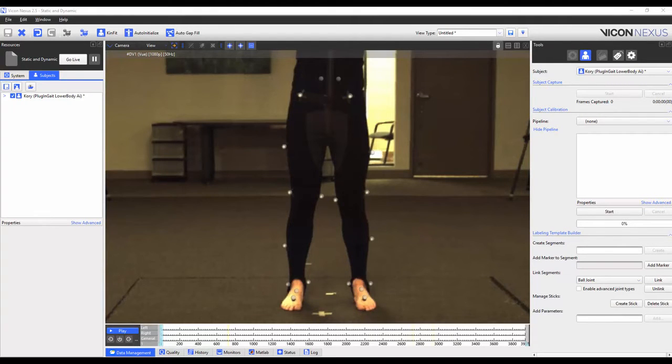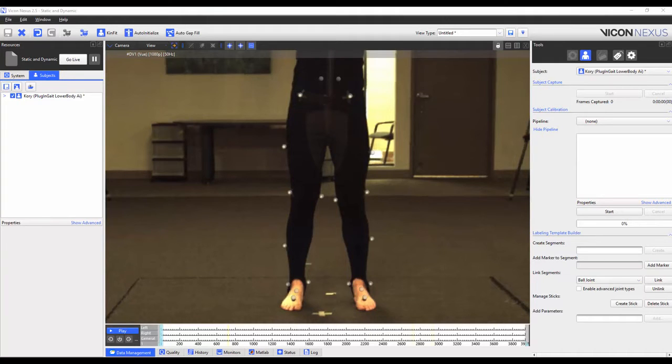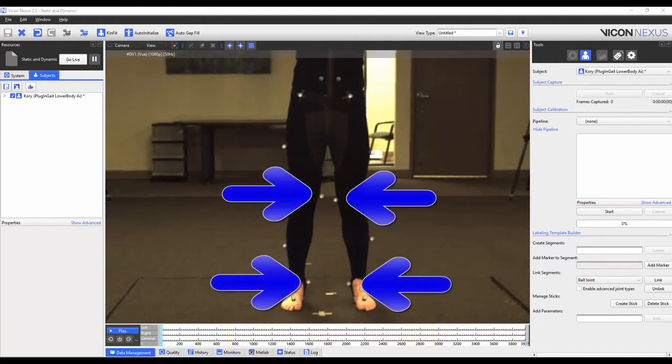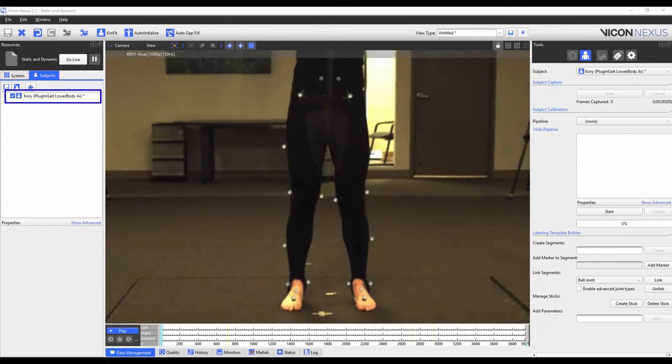Welcome to the Nexus 2 help guide. In this video we're going to show you how to add extra markers to a plug-and-gate model. In this video we'll be adding medial ankle and knee markers to the plug-and-gate lower body model.